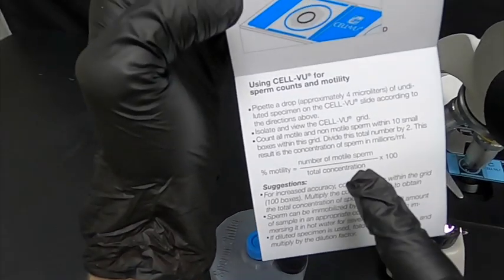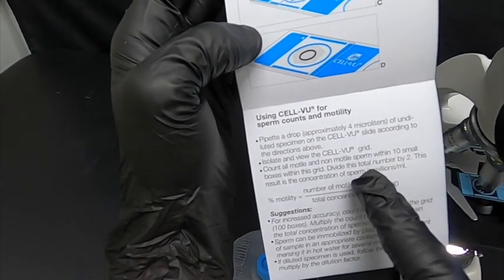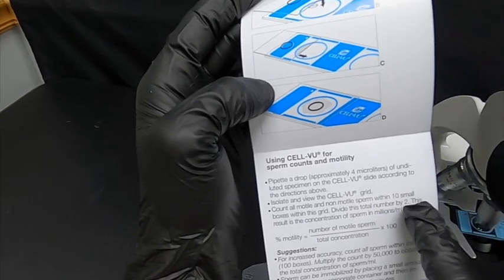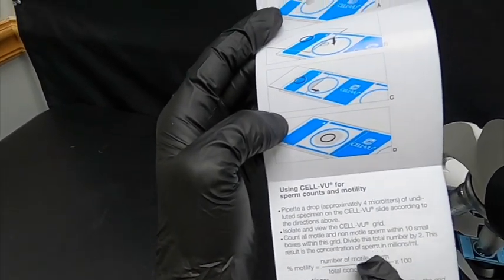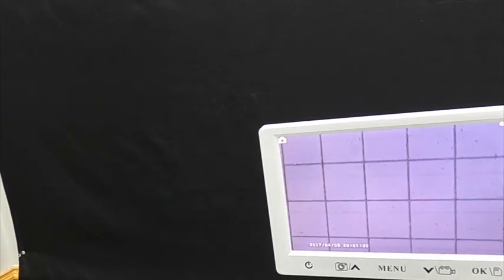As indicated in the instructions, we're going to count all the sperm observed, regardless if they're moving or not, within ten of those small boxes. With the 10x here, we're showing ten, another five partial on top. Let me move around to show you what we're seeing. This count is fairly low because we have semen that's already extended.